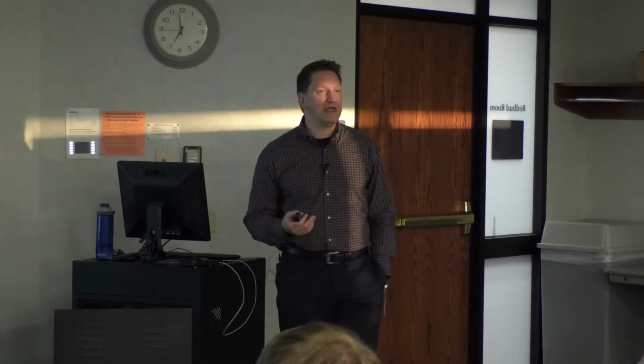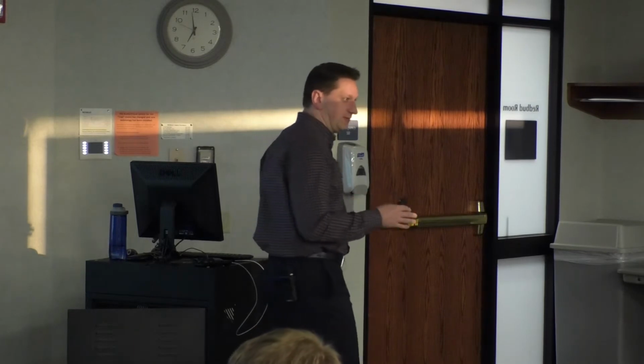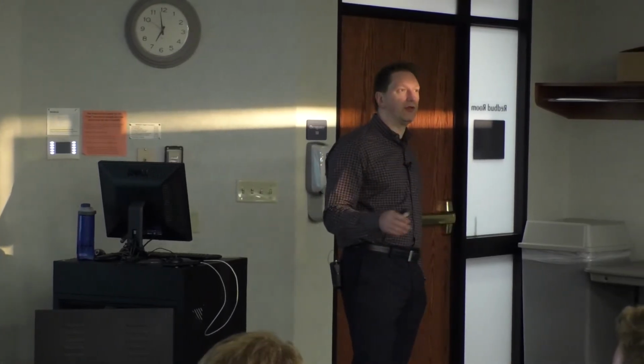All right. So ECG axis is relatively easy to determine whether it is normal, okay? It's easy to determine whether it's normal. Are you ready? Write this down. If lead 1 and lead 2 are both positive, it's normal. The end.